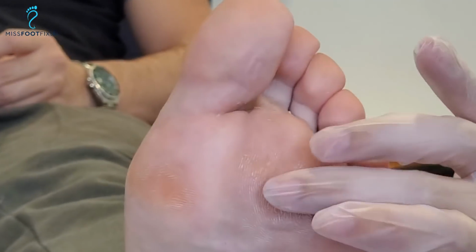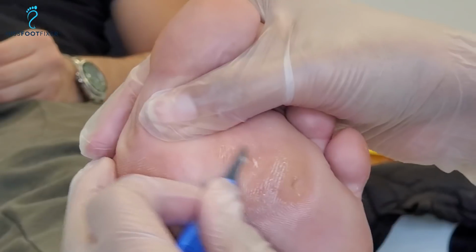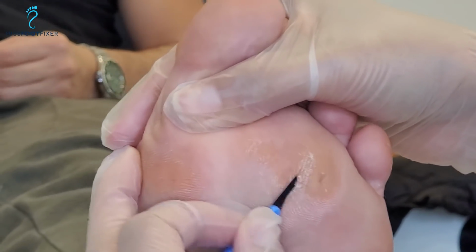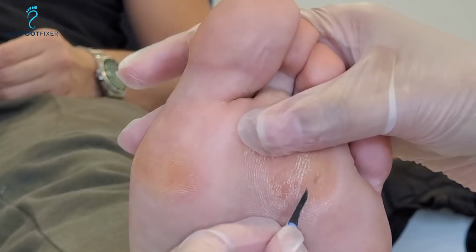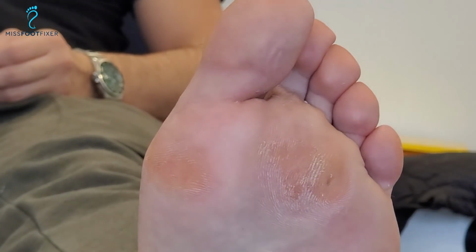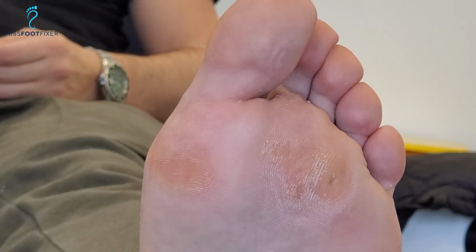How is everything feeling? Everything is good so far. Good. No pain at all, which is fantastic. Wonderful. So obviously I've taken out the first layer, and now I am going to go in with the scoop. Stephanie, you're going to zoom in for me, please. A small scoop, like a two. Yeah, that's good. Two, yes, awesome.